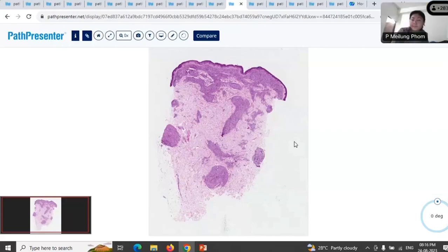So this pattern is virtually diagnostic of this disease. Can you tell me what is the pattern that you're seeing here? It's a nodular pattern. That's right, because we are in the spectrum of nodular dermal infiltrates. Anything striking about this pattern? Isn't it very peculiar? You see this? Storiform.